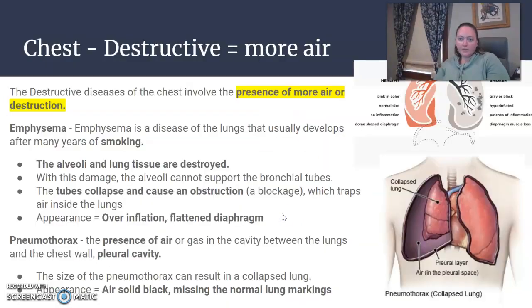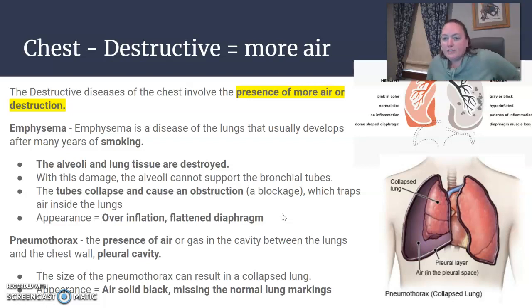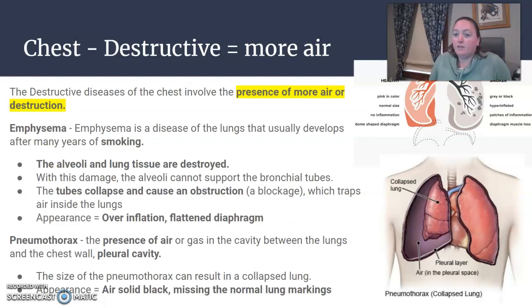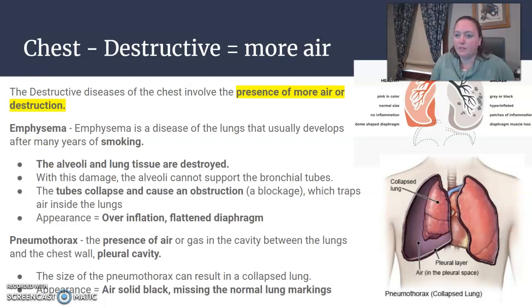We are back with the destructive diseases of the chest. The destructive diseases involve the presence of more air than normal, or destruction or collapse of something. Your two main destructive diseases of the chest are emphysema and pneumothorax.